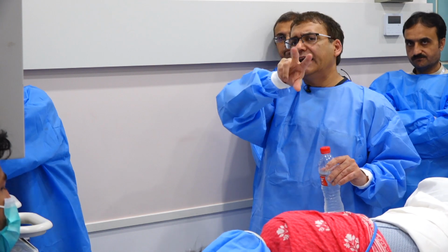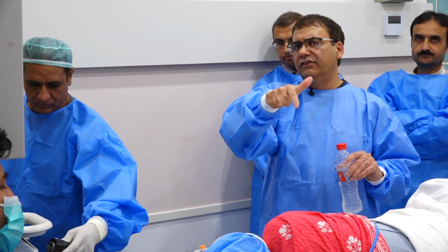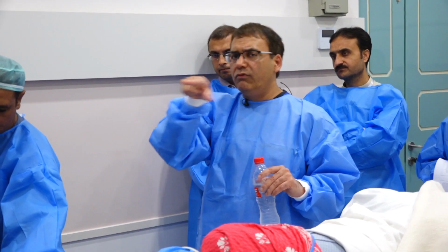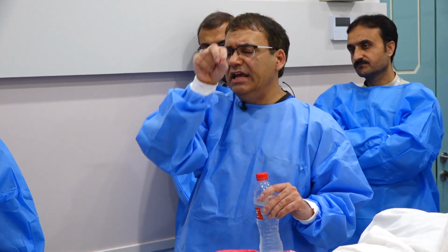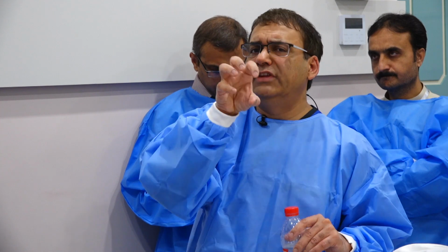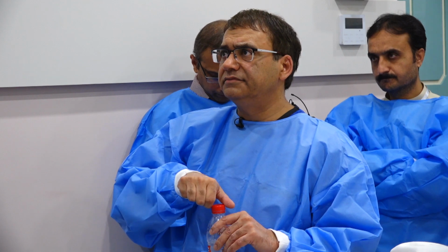Thickening of the bile duct can happen for two reasons, either an inflammatory process or a malignancy. Whenever the thickness is because of malignancy, you don't see any wall layers of the bile duct. If, however, it is an inflammatory process like cholangitis, you see 3 layers of the bile duct wall. There are 2 a little bit hypoechoic and 1 in the center hyperechogenic. So that shows it's an inflammatory process. But usually you see a mass or you see a very thickened bile duct which has no wall layer differentiation in there.